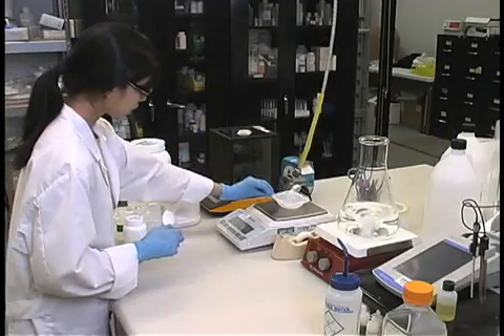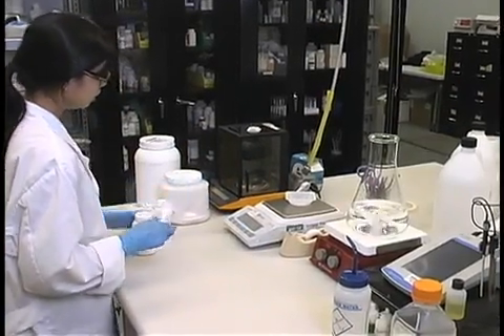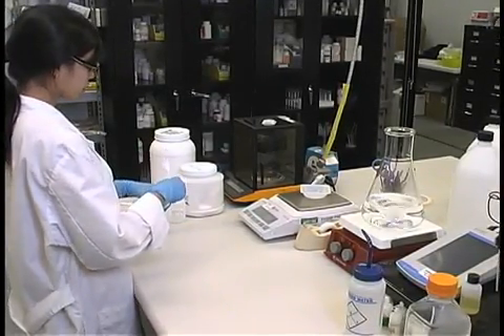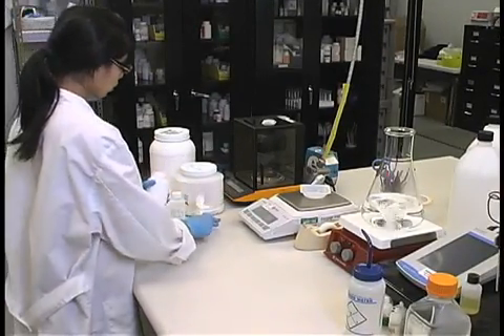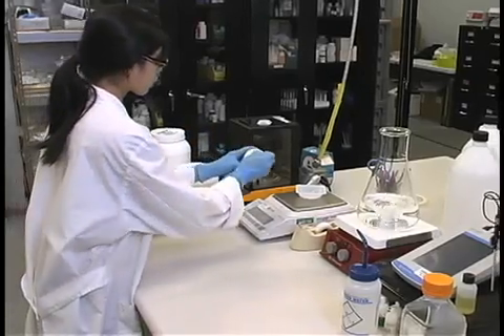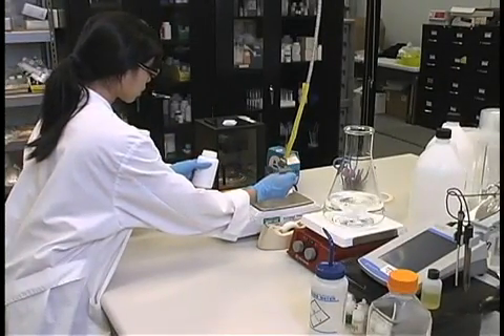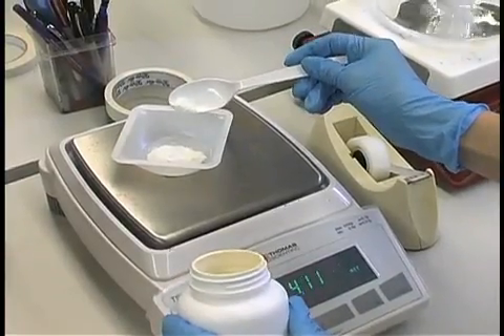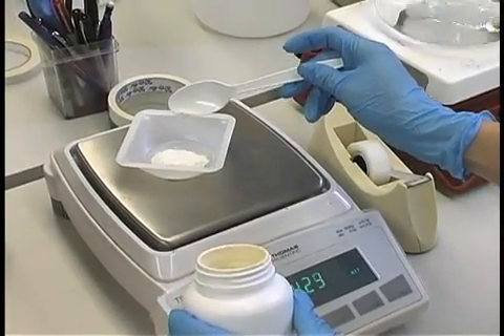Weigh out the desired amount of medium that is going to be prepared. Using a pre-formulated dry powder medium will reduce the number of components to be weighed and reduce the possibility of error. Phytotechnology Laboratories offers over 100 different formulations of plant tissue culture and microbiological media. Always use either a weigh boat or weighing paper when weighing out chemicals to protect your balance.